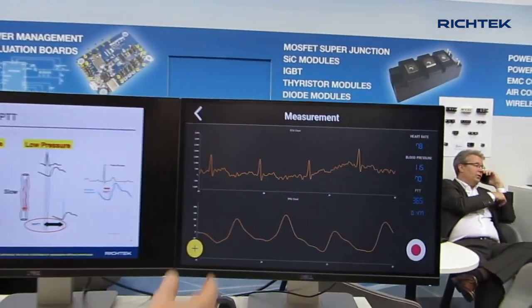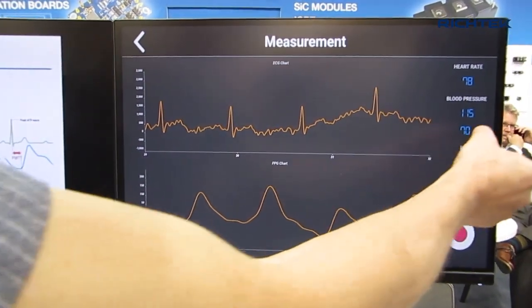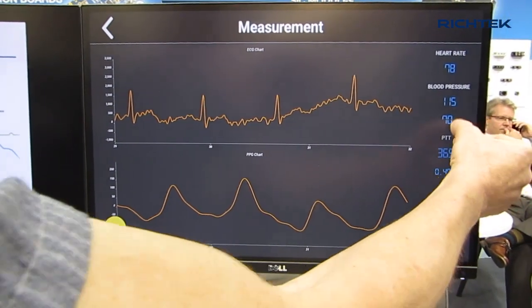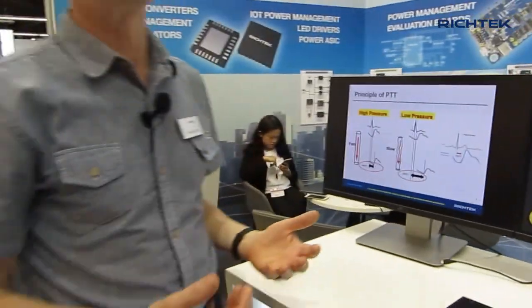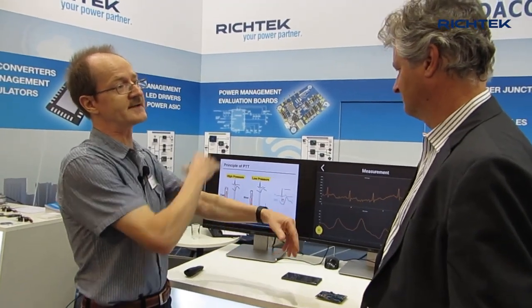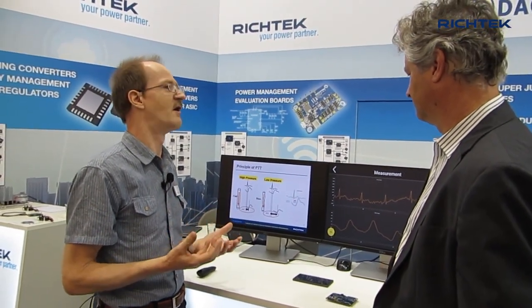In this waveform you see the R pulse and the PPG waveform, and the software has made a calculation from this time to this time, thereby making an estimation of your blood pressure — high reading and low reading. This measurement is quite convenient because normally for blood pressure you need to add a cuff that needs to be pumped up, you have to measure and reduce the pressure. This is really not a comfortable measurement and not one you can do very often in a day.